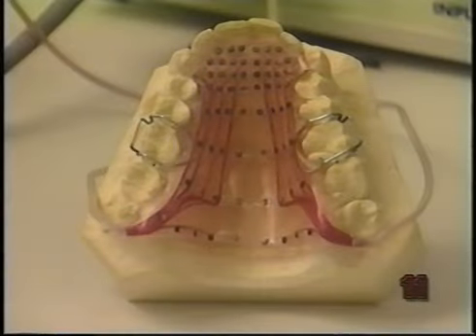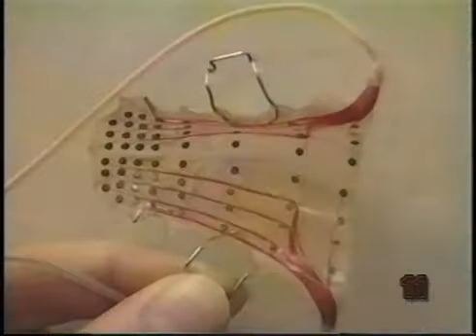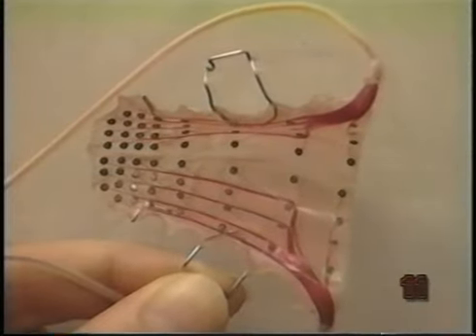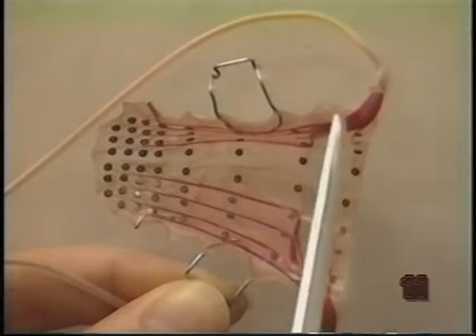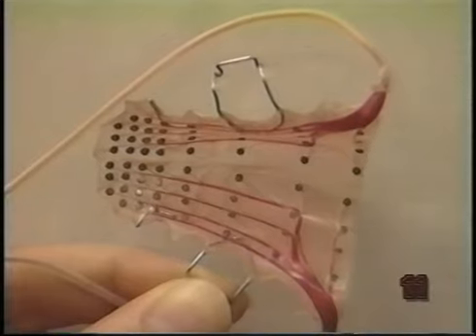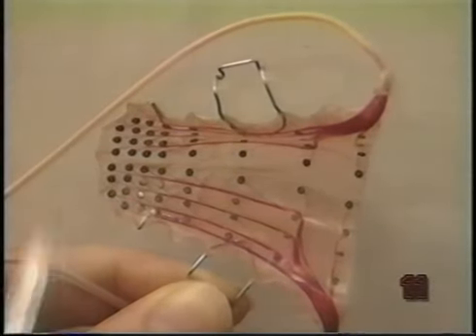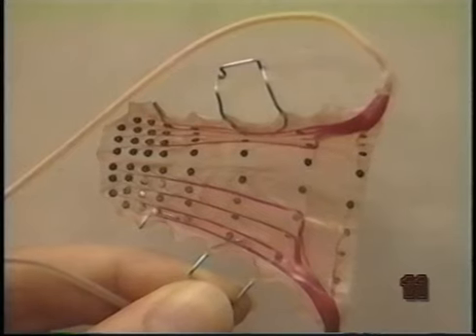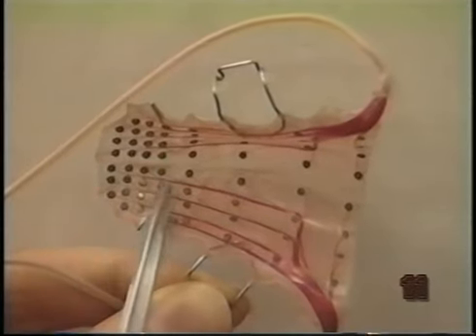First, we construct a thin acrylic palate made from a plaster impression. It has 62 silver electrodes serving as contact points embedded in the material. The rows of electrodes are placed according to anatomical landmarks. For example, the back row is at the junction between the hard and soft palates, and the front row at the place where the upper front teeth meet the alveolar ridge. Rows are placed proportionately on the surface, with the front 4 rows being closer together than the back 4 rows.